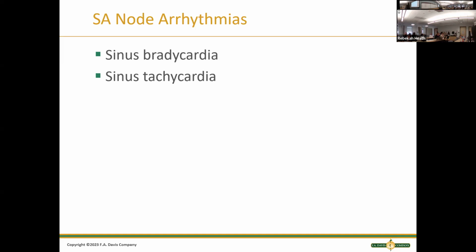All right, what is the rate that we have on this? How many QRS complexes? 12, thank you. Yeah, we have 12. We multiply it by 10 to get 120 for our heart rate.